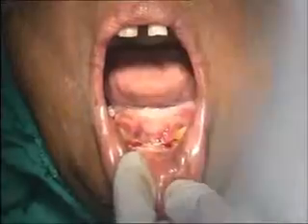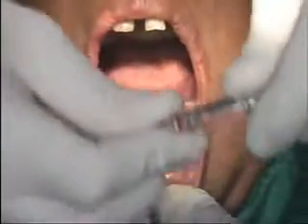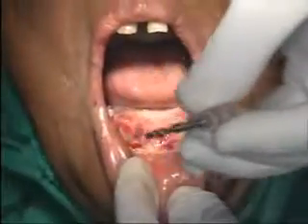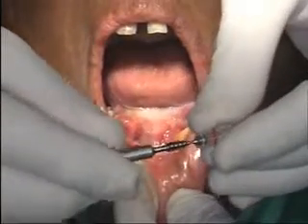I will not open it in the patient's mouth because the liquid will go inside. Can you see in the camera? Yes sir, okay. I will take the implant. Ali, transmission is very good here. Yes, I can see. Very good. Excellent. Thank you.